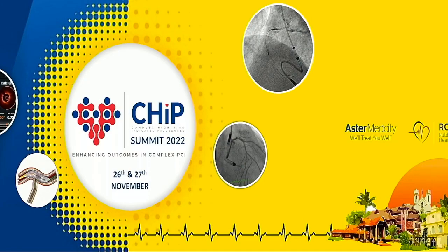Yeah. And regarding sending IVUS, this OptiCross catheter will go through a 6 French guide extension. And in fact, in all low contrast PCIs, especially if you are doing it in a vessel which is very tortuous, it's often very difficult to send short monorail IVUS catheters into the distal segment of the coronary, as well as into the LCX, which is usually, if it is more than 70 degrees bend. So in such cases, preemptive Guideliner usage to send imaging saves a lot of contrast, and a lot of your time also. So it can also be used in very low contrast PCIs, in tortuous vessels and in LCX. Yeah. Thank you, Dr. Praveen.